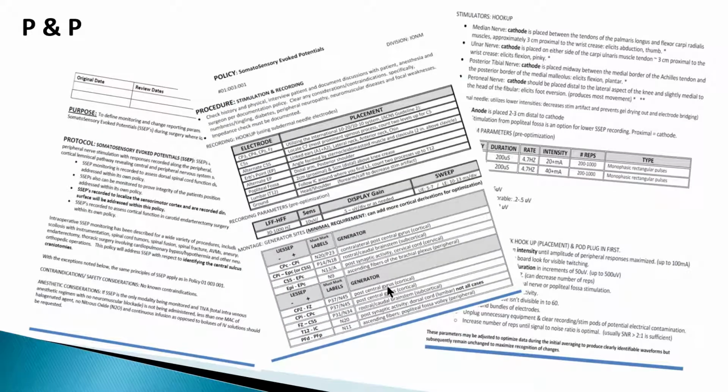Our first line of defense is to have a good policy and procedure manual. It should be literature-based and cited. It should also be signed by all employees, the interpreters, and the surgeon. I've been asked to provide an abbreviated version to the surgeons in order to give them pertinent information that's important to them.